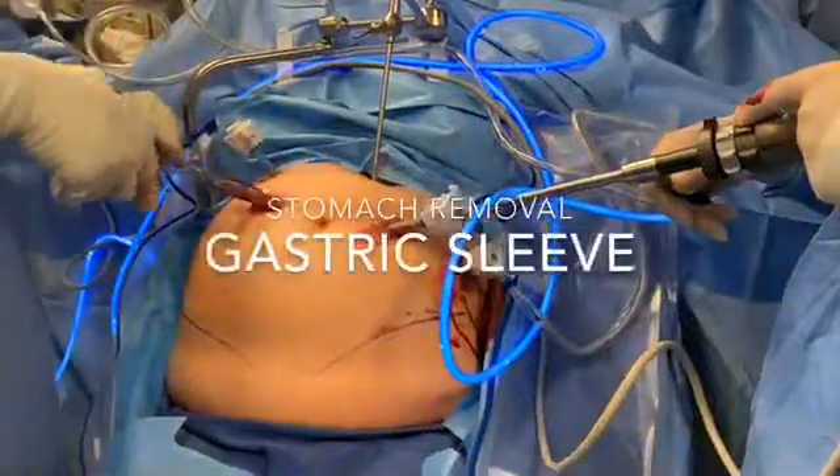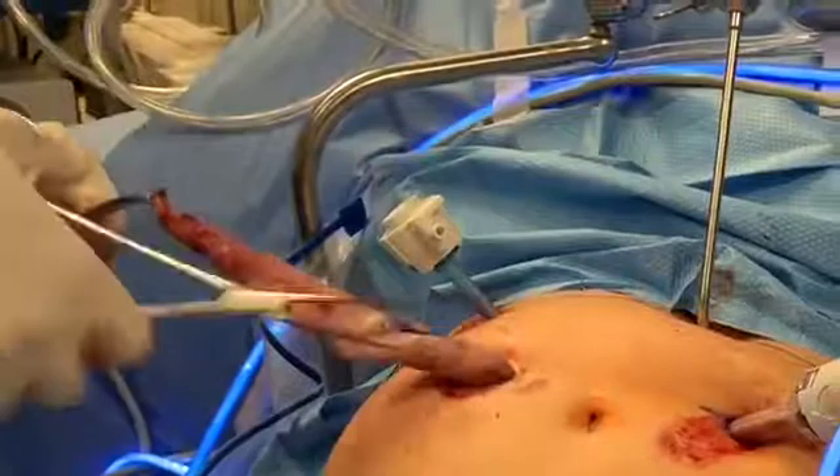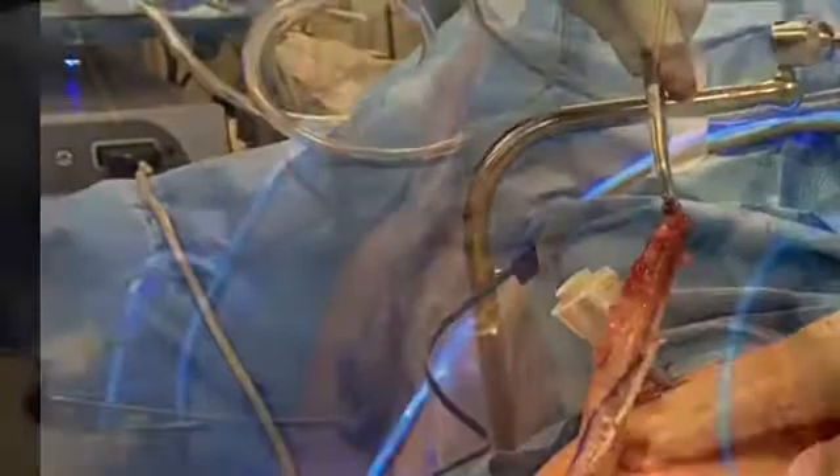This video demonstrates the extraction of the resected stomach after a laparoscopic sleeve gastrectomy. It is removed through a one centimeter incision fairly easily.